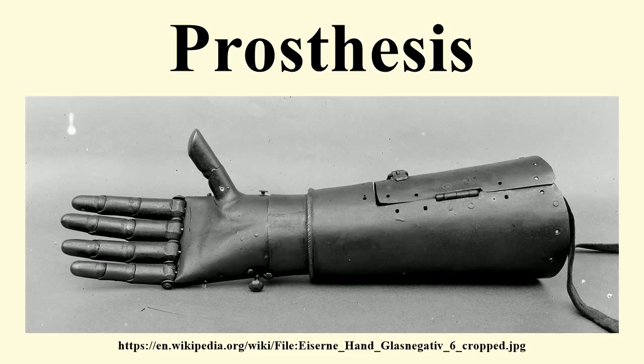Patient procedure. A prosthesis is a functional replacement for an amputated or congenitally malformed or missing limb. Prosthetists are responsible for the prescription, design and management of a prosthetic device. In most cases, the prosthetist begins by taking a plaster cast of the patient's affected limb.